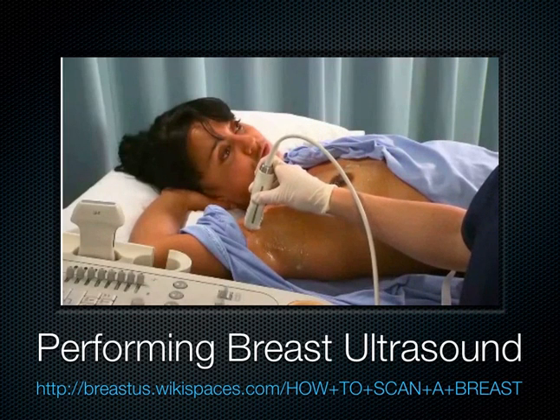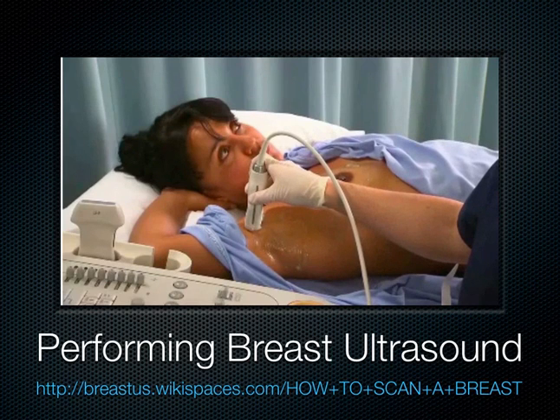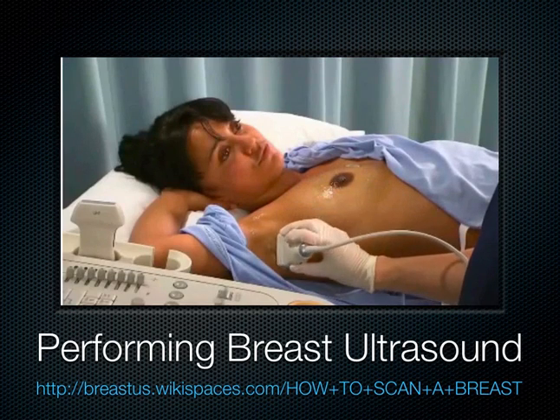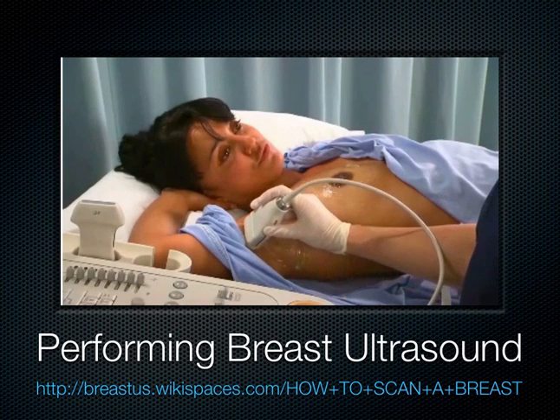Repeat the process in the transverse plane. Place the transducer in the superomedial aspect of the axilla in a transverse position. Slide inferiorly, then laterally, and finally superiorly until the whole axilla has been examined.